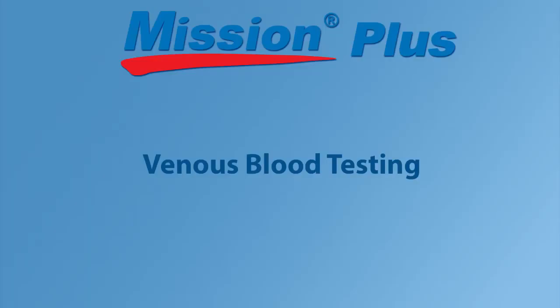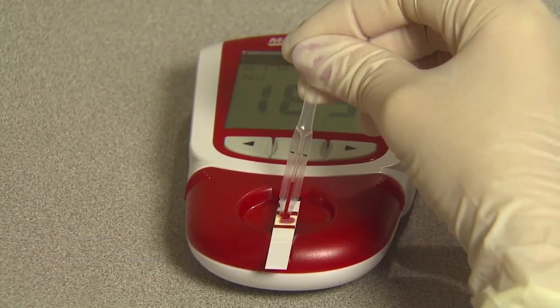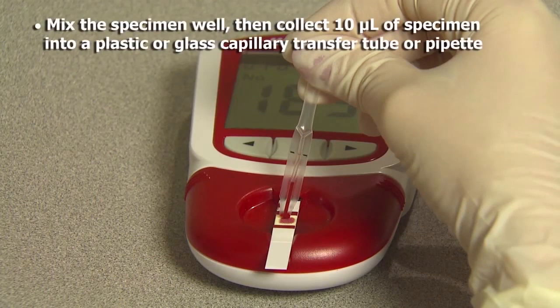Venous blood testing. For professional testing using fresh, heparinized or EDTA venous whole blood, mix the specimen well, then collect 10 microliters of specimen into a plastic or glass capillary transfer tube or pipette. Apply it to the center region of the specimen application area of the test device or strip without touching the device or strip with the pipette or tube.